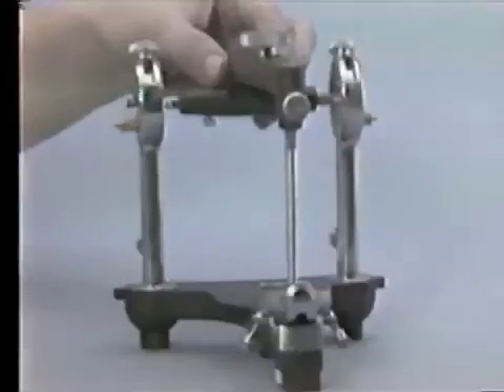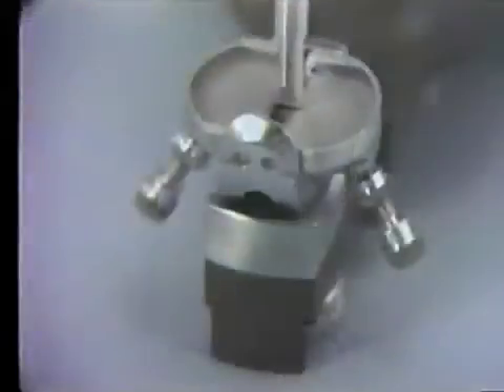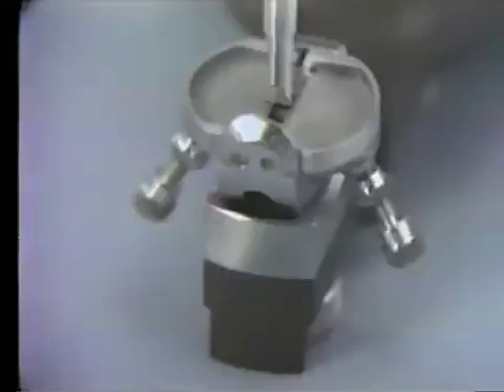The pin must also be centered laterally. If it is not, and the incisal pin is the correct length and not bent, the condylar shaft housing will have to be adjusted.